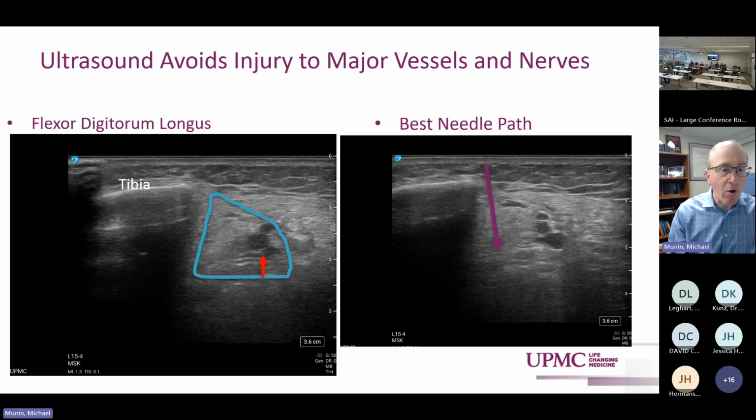The other thing I'll say about the utility of ultrasound guidance, just two other quick points for those who aren't as familiar: we see our patients 3 to 4 times a year, and if we can do our injections in a way that causes less pain, that is going to improve their willingness to come see us on a regular basis and not drop out.